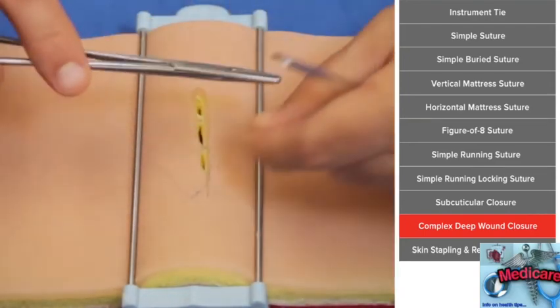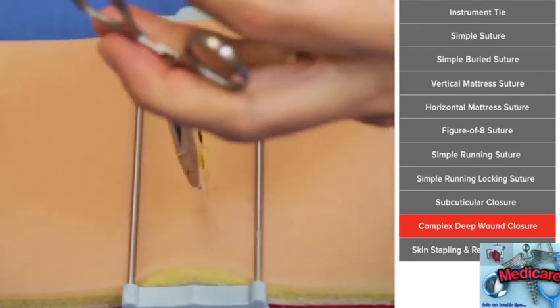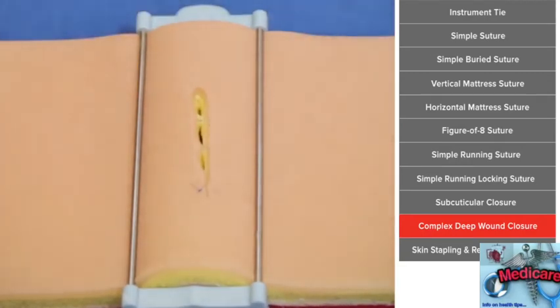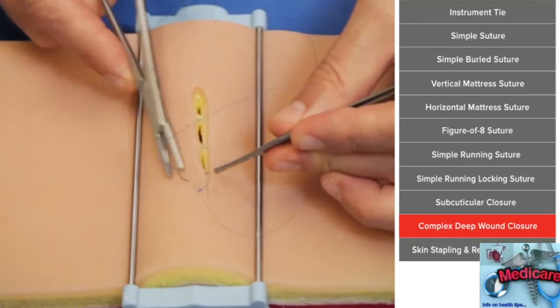Okay, so now we have the dermis closed, now we're going to have our skin closure. This is your closure of choice. You can do a running suture, you can do interrupted. This will totally be up to you. Here, because it's a complex closure and I believe it's under a lot of tension, I'm using the vertical mattress.